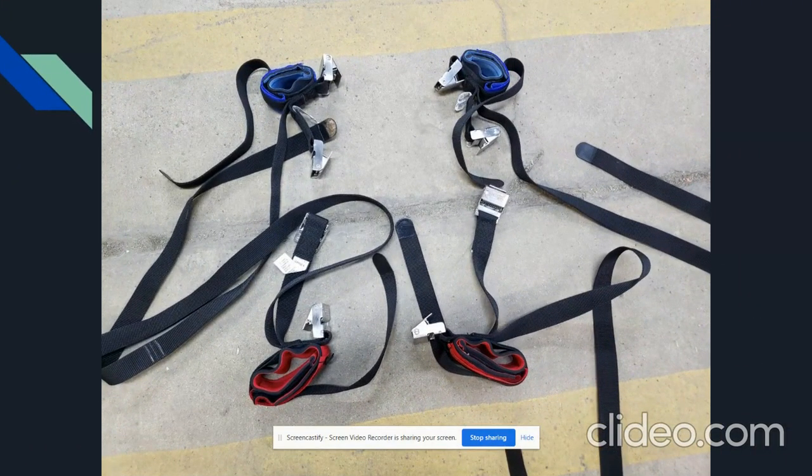Here is a picture of the restraints. As you can see, there are 2 blue ones, which are for the wrists, and 2 red ones, which are for the ankles. You can see there's enough slack so you could put these restraints anywhere. At the agency I worked with, they are not mandatory to be on the EMS cot at all times. So if we do get called to an aggressive patient, we will put them on prior to going and seeing that patient.